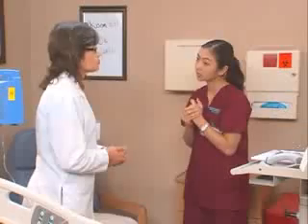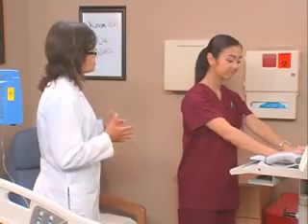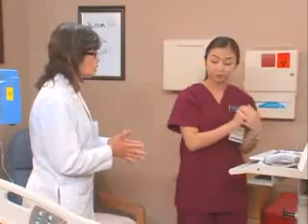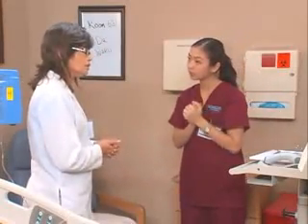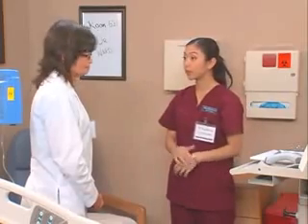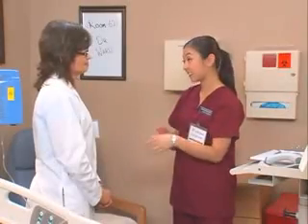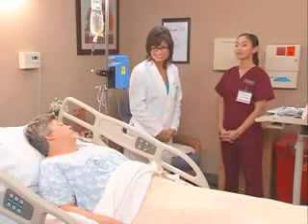So you've got the blood pressure measurements and pulse rates from 3 different positions. We're going to record the measurements for each position, noting the position with the readings. And if you have an increase of 40 beats in the pulse rate or a decrease in the blood pressure of 30 millimeters of mercury, what's that tell you? Well, that would be a cause for concern, but fortunately, not the case for Mrs. Paolini. There was very little change in the measurements from lying, sitting, and standing. Well, that's good, right? Yes, that's a good thing.